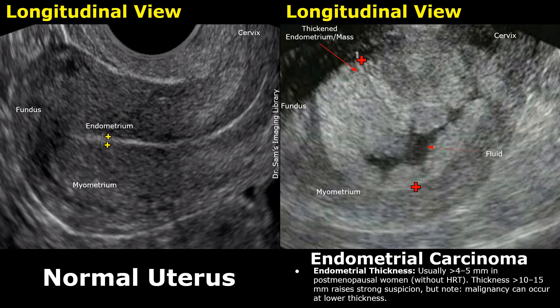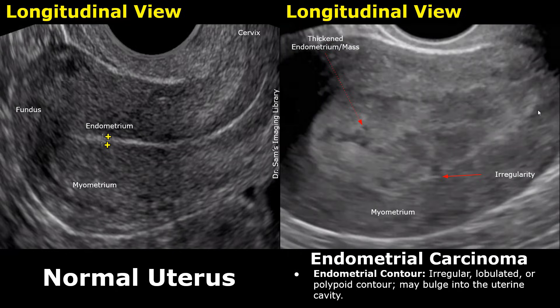In this case, there is diffuse endometrial thickening with some hypoechoic fluid areas, making its overall echo texture heterogeneous. One important feature which distinguishes endometrial carcinoma from endometrial hyperplasia is that the thickened endometrium or mass has irregular contours.